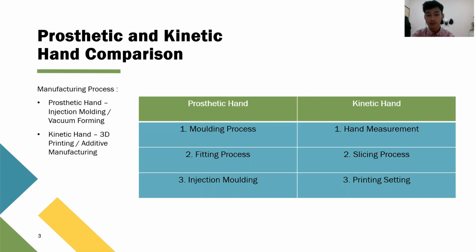Next, liners are used as a protective covering, which is typically made of medical grade silicone, followed by a fitting process using a thermoplastic sheet. Thermoplastic sheets usually are made of polyethylene and polypropylene. Next, by using a heating system, modifications are quickly made to maximize mobility and comfort. Custom sockets are used to spread mechanical pressure uniformly around the amputation site and the interface of the prosthetic limb.